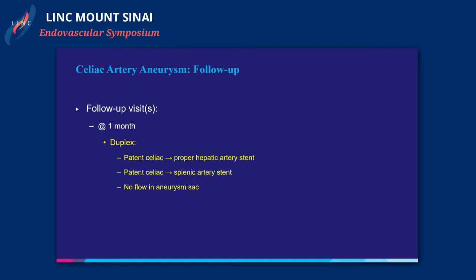You never really saw a compression of the celiac axis. Yeah. And we've all seen it where you see the median arcuate ligament come down and you get aneurysm beyond that. That was one I think you would obviously fail if you put a covered stent there.